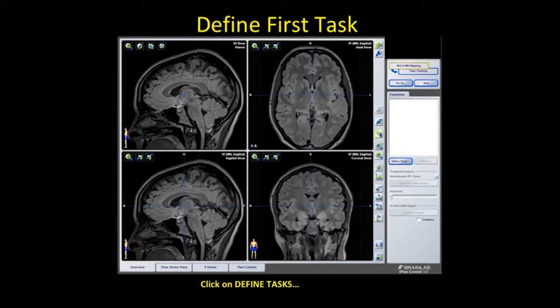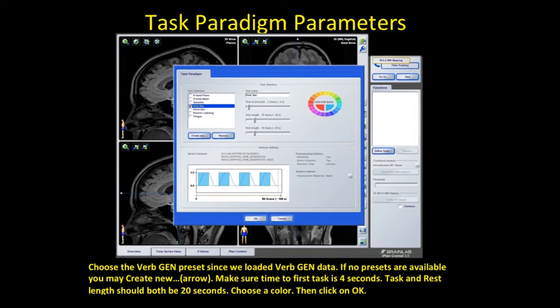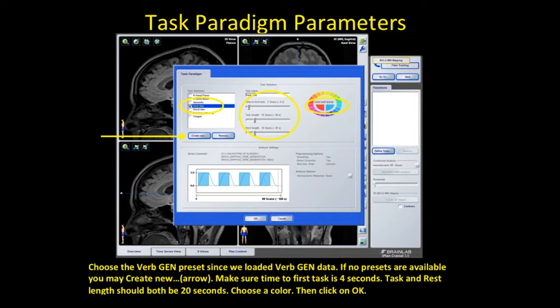You now want to define this first language task. Choose the verb generation preset since we loaded verb gen. If no presets are available at your center, you can create new presets with the tab highlighted by the arrow. At our institution, the first task is set to start at 4 seconds, and task and rest length should be 20 seconds. Your institution may have different timing, so make sure you know those — just ask your MRI tech. Then choose a color and click OK.